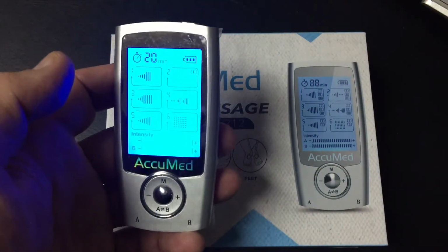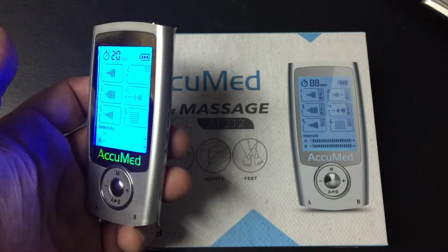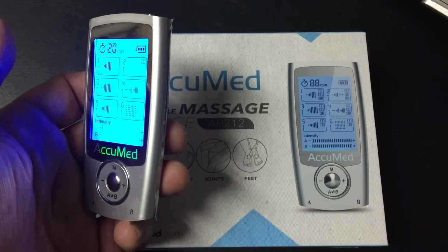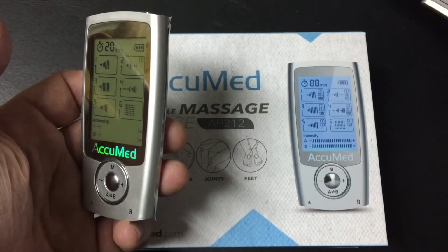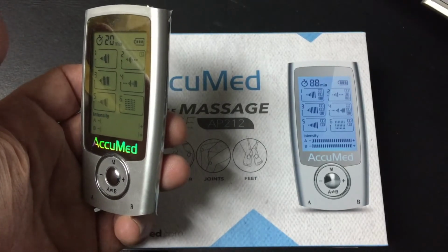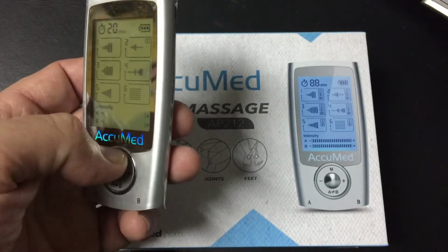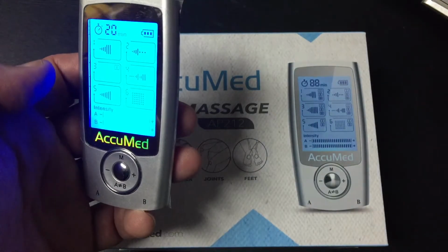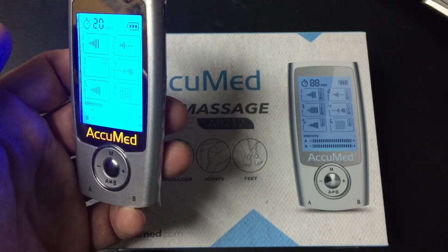Mode 2 is called the acupuncture mode. Sorry if I'm holding this at an angle, but it helps with the glare. On acupuncture mode, you've got short pulses that start strong and fade away gradually, so it's kind of a poking feeling. This is a really good mode. I like this one. Mode number 3 is your beat mode, and it's quick, strong pulses in a rhythm.